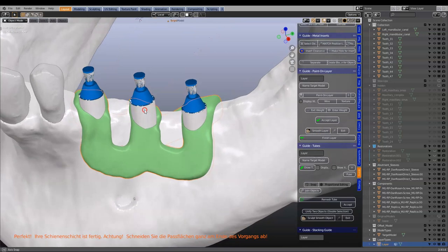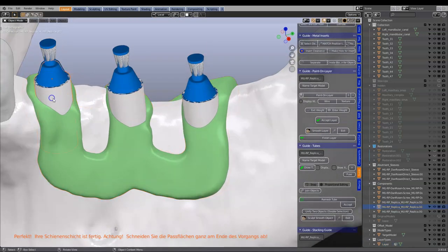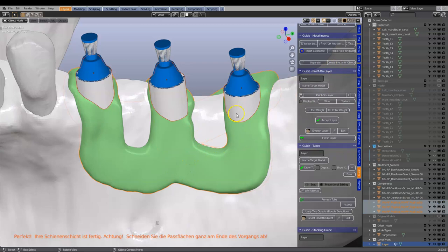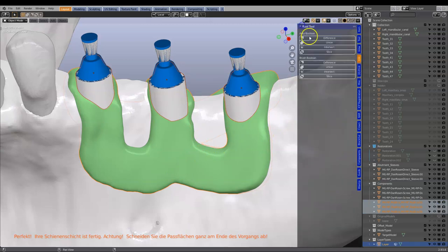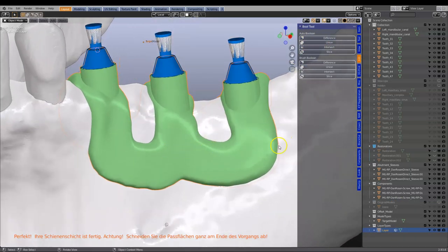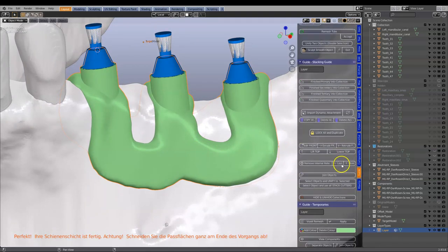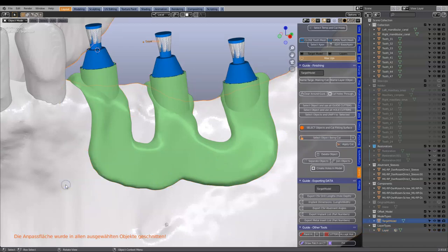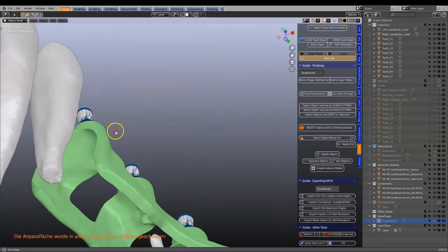The next thing I want to do is unify these multi-unit abutments to the layer. I'm going to take them, select the green layer last, go to Edit > Bool Tools > Union. Following that we can cut out the inside of it — back to the guide module, go to where the finishing is and click the button to cut the fitting surface. Now that we've got the fitting surface, this is what it should look like.